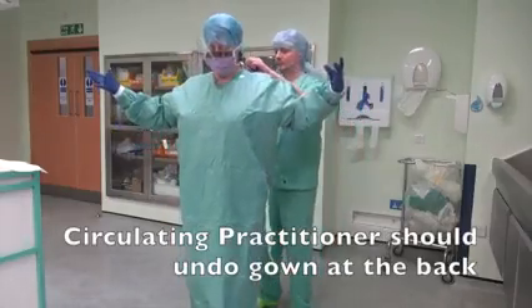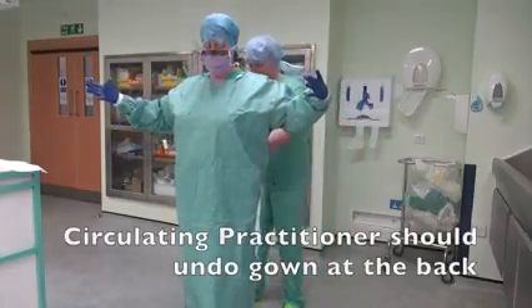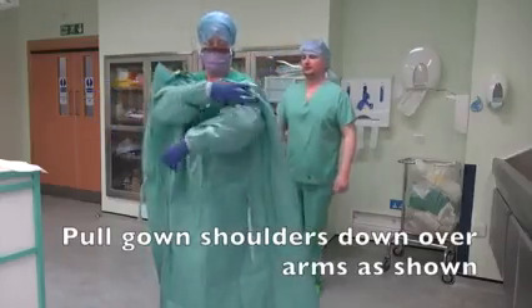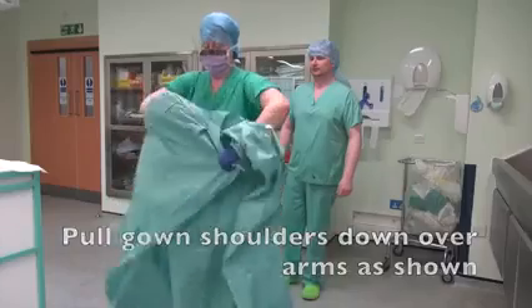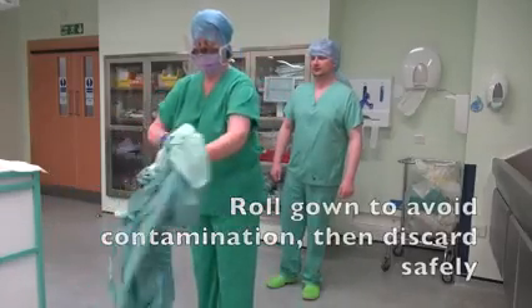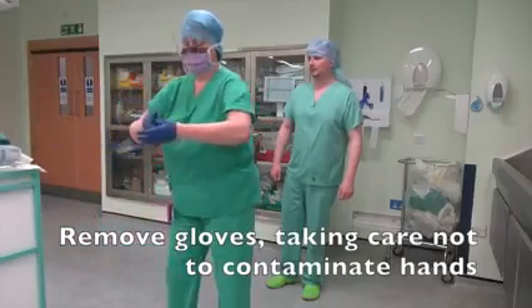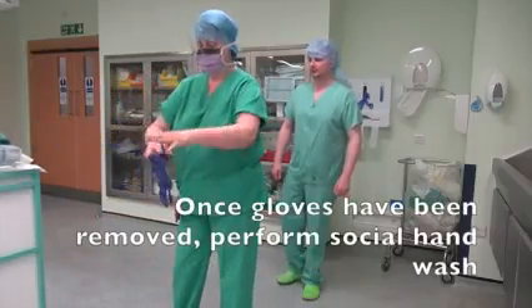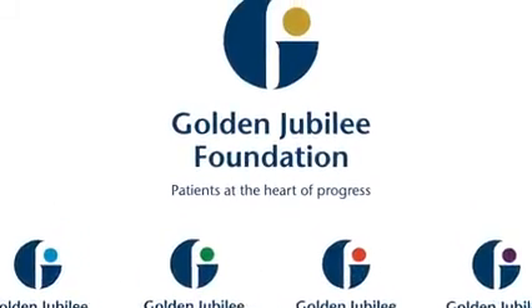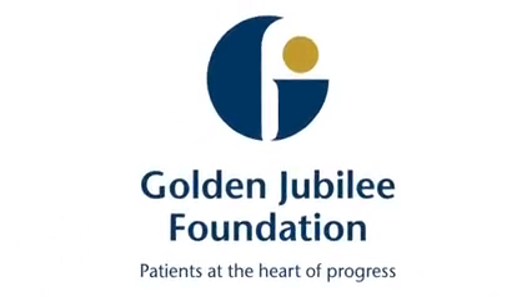The circulating practitioner should undo the gown at the back. Pull the gown shoulders down over arms as shown. Roll the gown to avoid contamination, then discard safely. Remove gloves, taking care not to contaminate hands. Once gloves have been removed, perform a social hand wash.